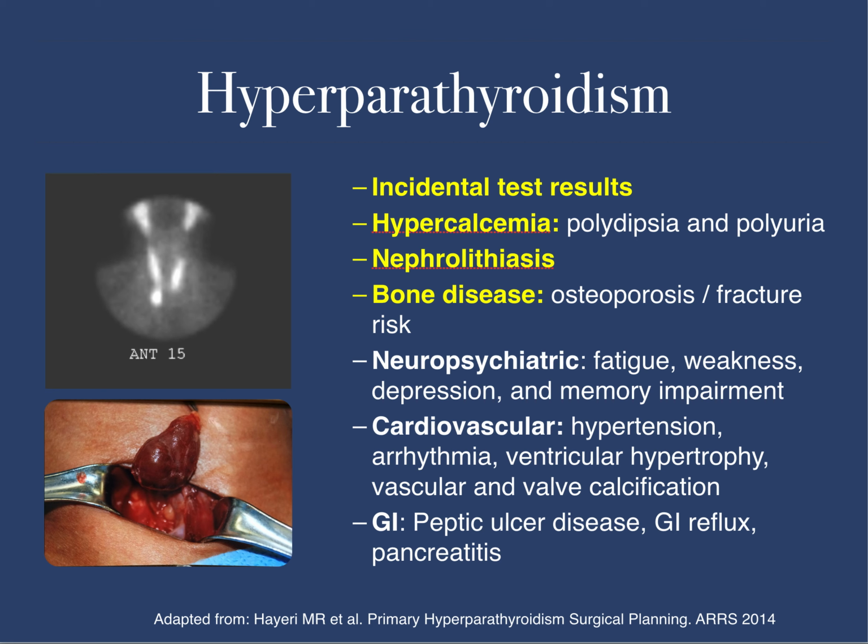The range of tests include nuclear medicine sestamibi scans, ultrasounds, multi-phase CTs, and MRs in theory, although MR has not proven to be super helpful. And these days, primarily the surgeons rely on nuclear medicine tests as well as on multi-phase CAT scans, frequently known as 4DCT.